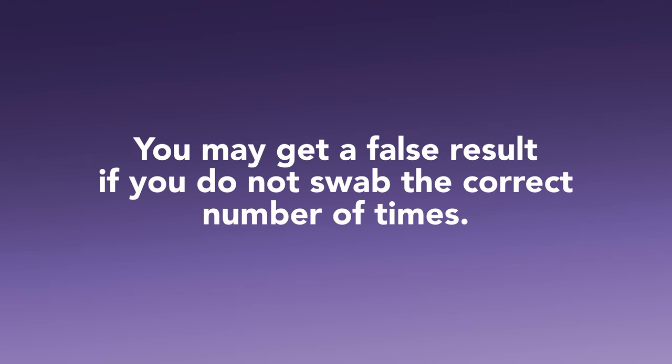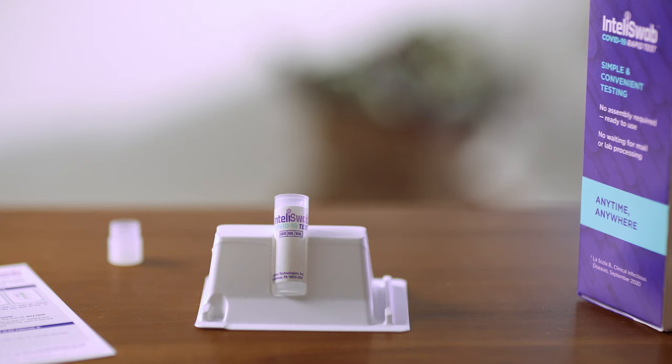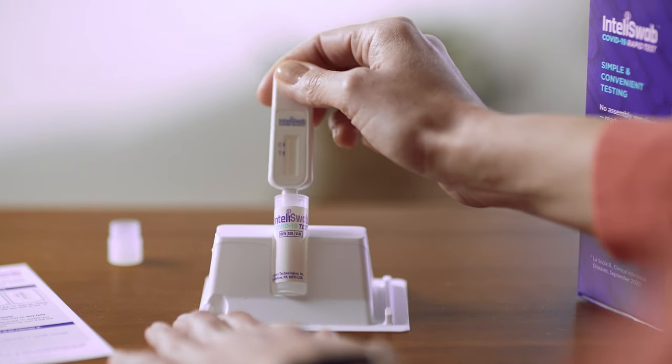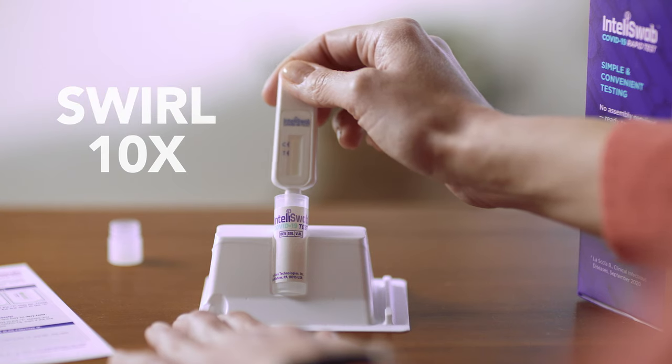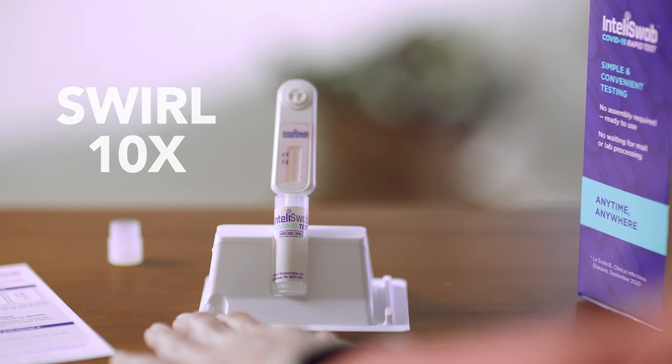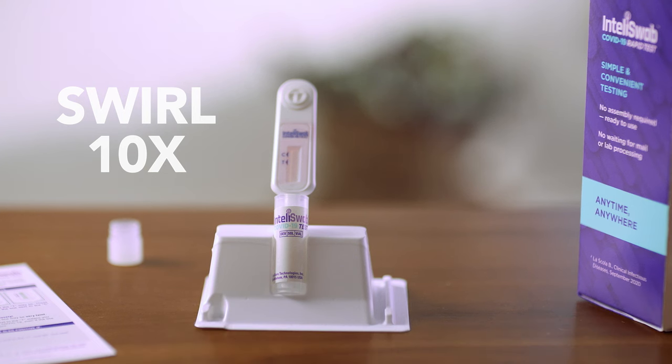You may get a false result if you do not swab the correct number of times. Once finished, hold down the test stand firmly and place the test device into the tube. Swirl the test device 10 times to mix the swab sample with the liquid in the tube. Make sure the swab is toward the back of the tube so that it makes contact with the liquid.